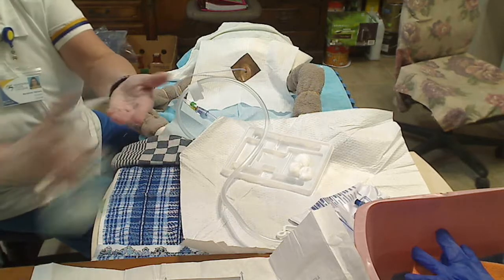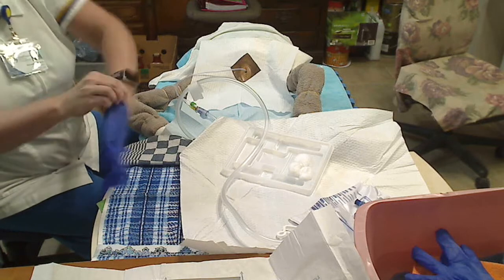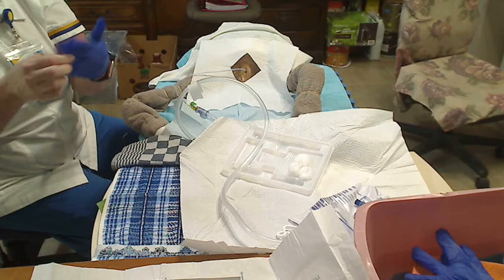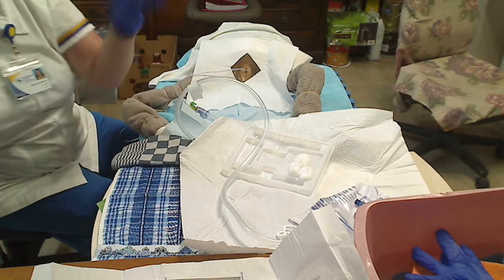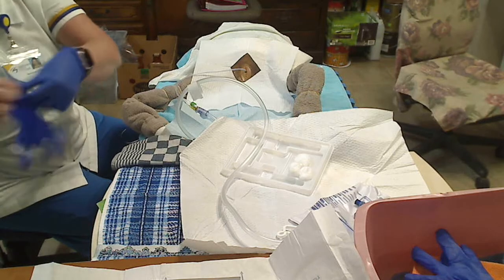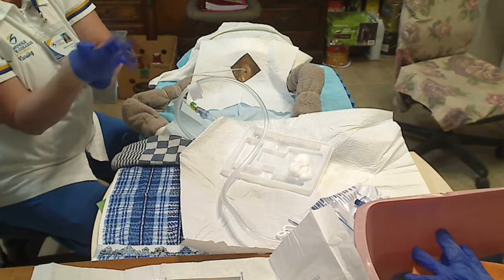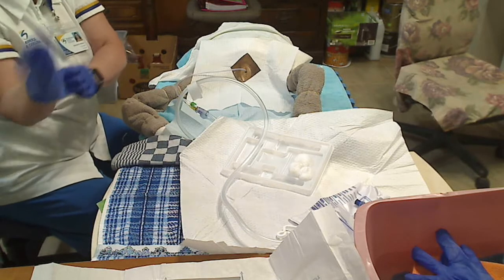I'm going to hand sanitize, and just for safety's sake, put on another pair of procedure gloves. Oh my goodness, these are small. That's what happens when the hospital's out of the right size gloves. You have to go to the next size down.